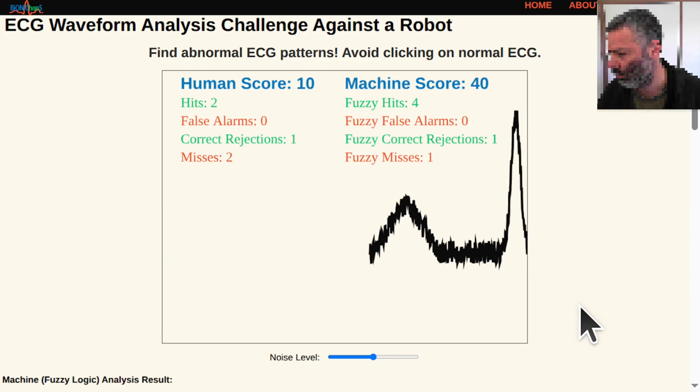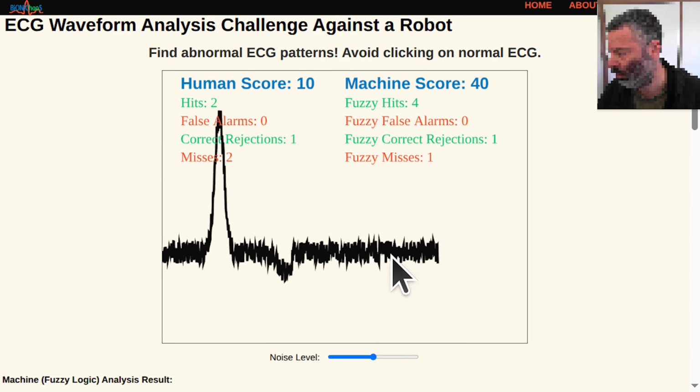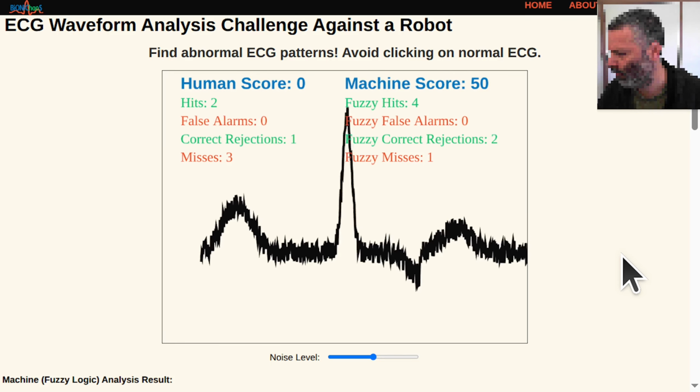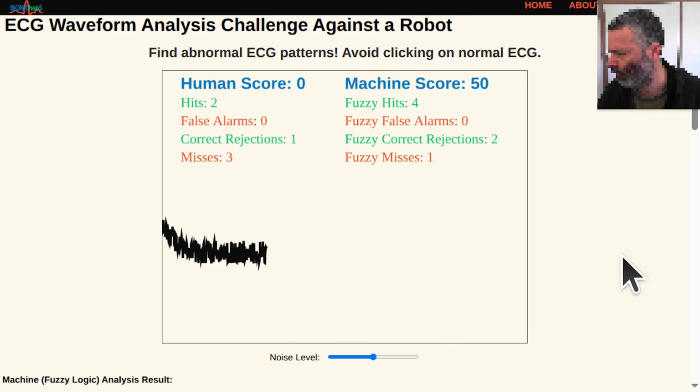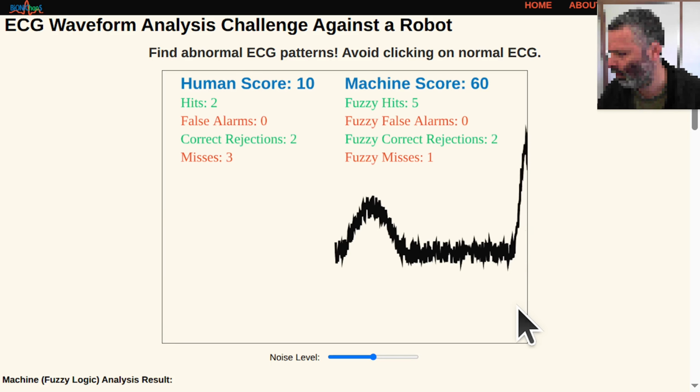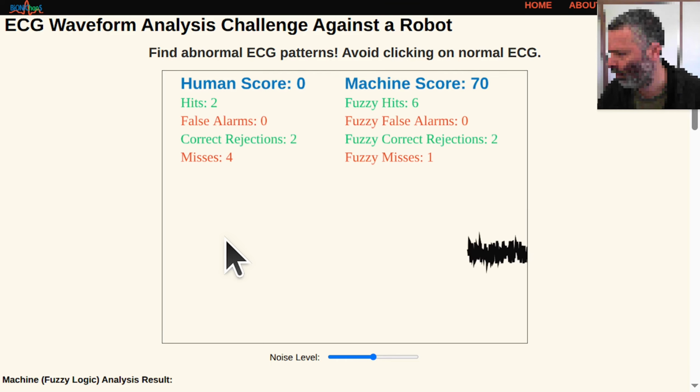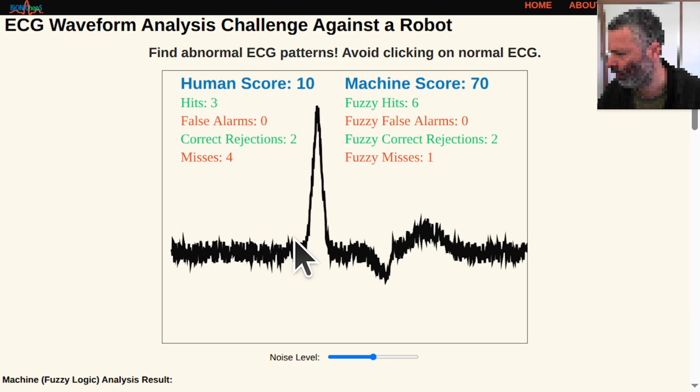The goal isn't just to be fast, it's to be more accurate than the algorithm, proving that the human expert is still critical. It's an amazing gamified diagnostic tool for students and a great way to kill time while also learning cardiology. Go beat the bot and prove humanity is superior.